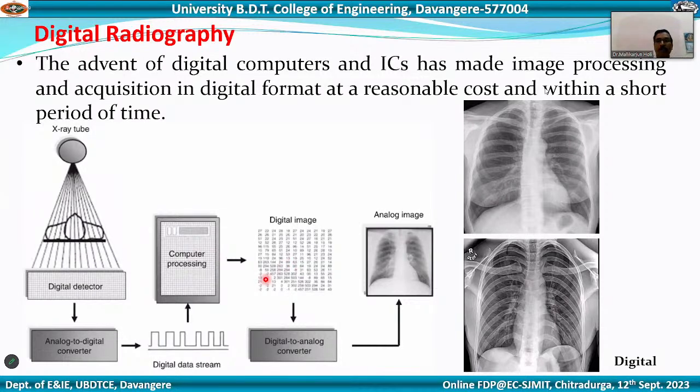Nowadays the majority of doctors visualize that digital image on their CRT screens and do the diagnosis, or you can print it onto film using a digital printer. Again, we convert that digital to analog, and we can get an analog image.